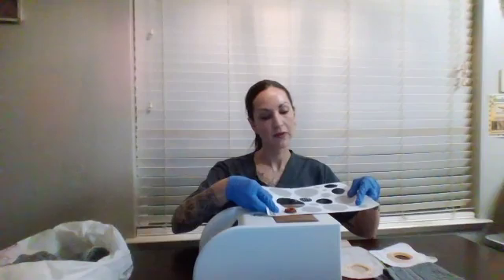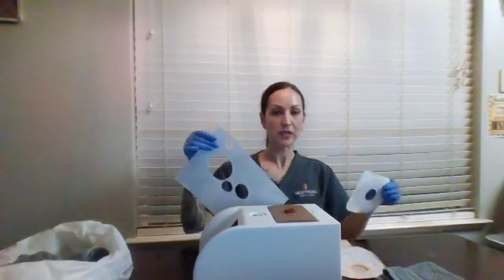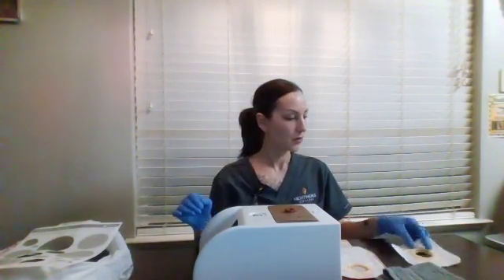Now we're going to use our stoma guide and measure for a precise fit. It looks like the precise fit for this stoma is 32 millimeters. You would get your new ring or face plate, take your guide, and cut it out for a good fit. Then you can toss your guide into the trash and set your ring plate aside.